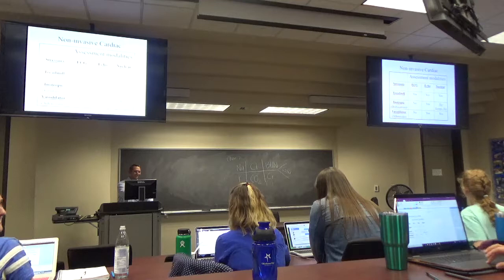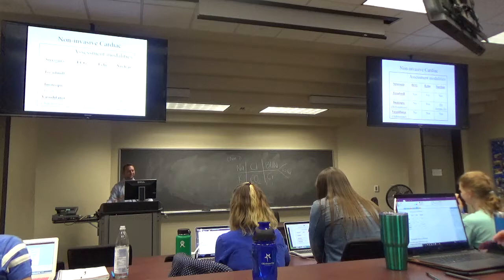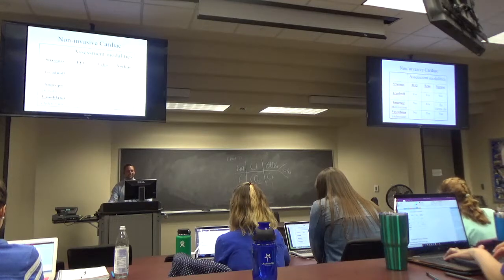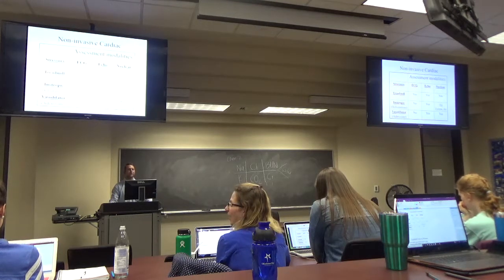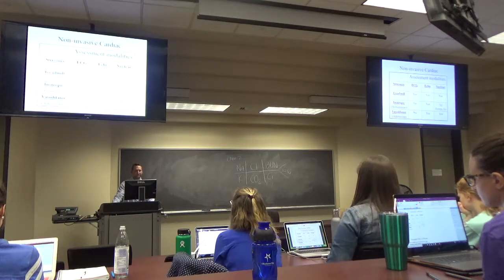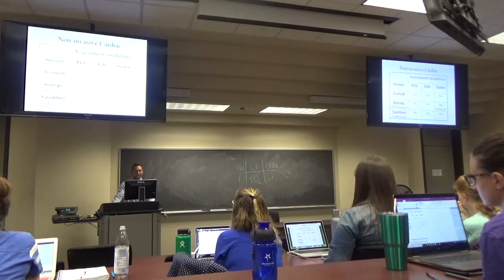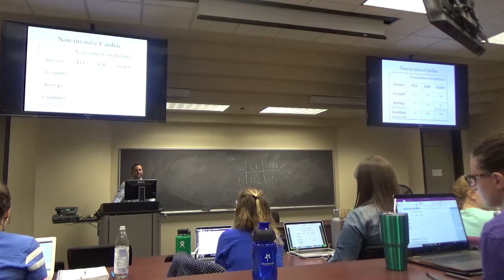I mean, these are the stressors over here. You've got the treadmill, the inotropic, which means the ones that make you pump faster, and then the vasodilators, adenosine. But I don't know what the yeses and noes are, so I'm sorry. The modalities are the stressors and what they use in each of those tests. On an EKG, they'll use an EKG for a treadmill. I don't know why it says no for the other two, because I guess you're not actually using your EKG for that. They're using that during your echocardiogram and during the nuclear medicine study.